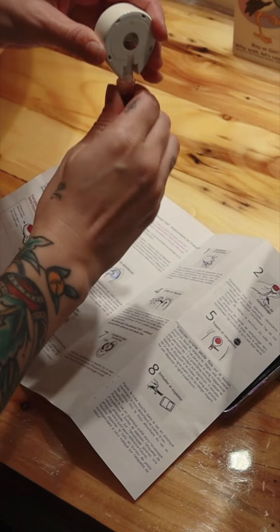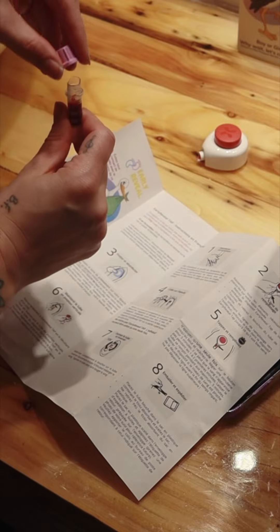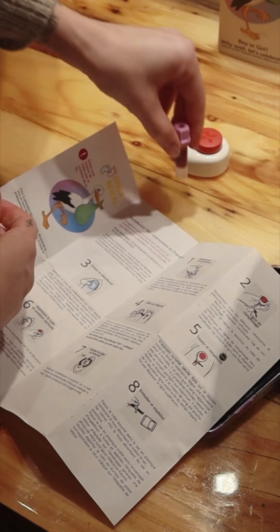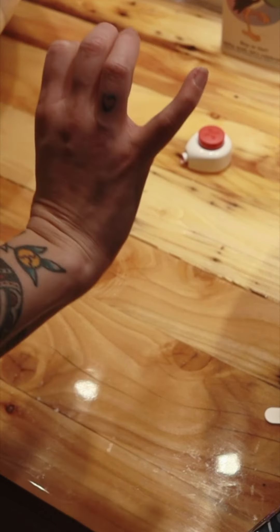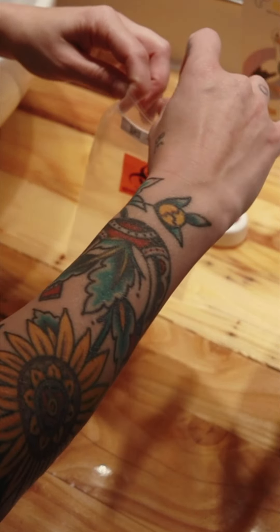Hold the tube vertically, pulling slightly downwards, then replace the cap on the tube. Gently invert the tube about ten times to mix the blood well and tap the tube to move the blood inside.